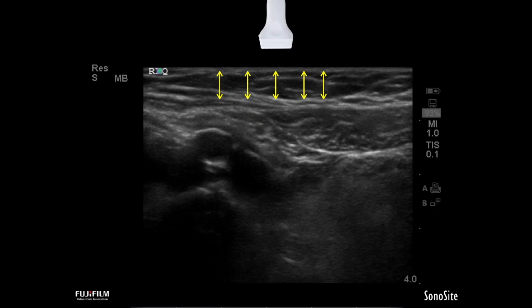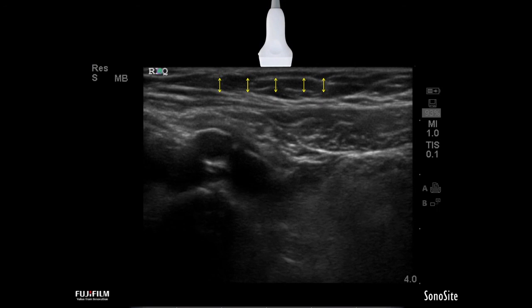The other thing I really need to remember is the concept of graded compression. Here we're using a high frequency linear probe to identify the appendix, but we have some overlying soft tissue. What we need to do is squish out that soft tissue and any overlying bowel gas to get a nice visualization of the appendix. A little bit of downward compression is going to squeeze that soft tissue, squeeze that muscular layer, and improve our visualization of the areas we need to identify.